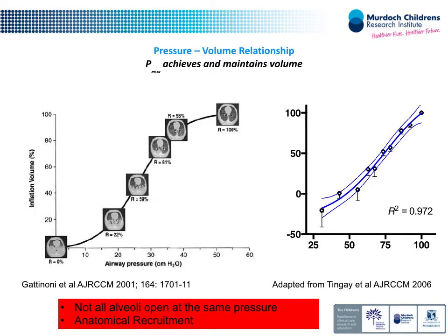And you can see here that right down here, the lung is very heterogeneous in its volume state. Some of the lung is totally collapsed; it's whited out. Some of the lung is black, which means it can engage in gas exchange. This is a very difficult lung to ventilate because the pressure that part of the lung needs is different from the pressure that part of the lung needs.